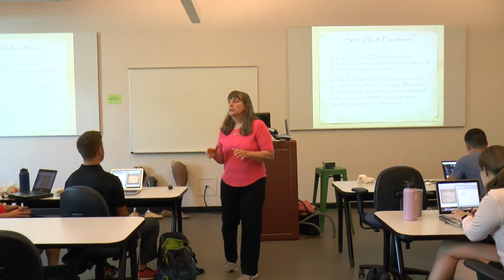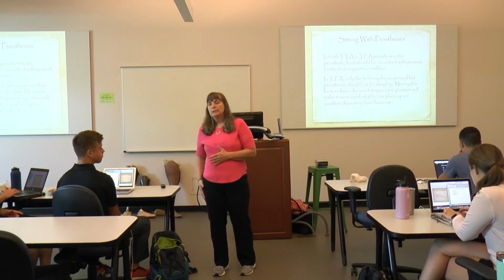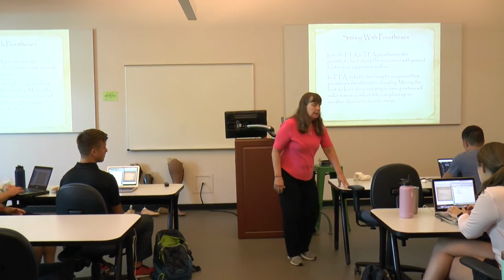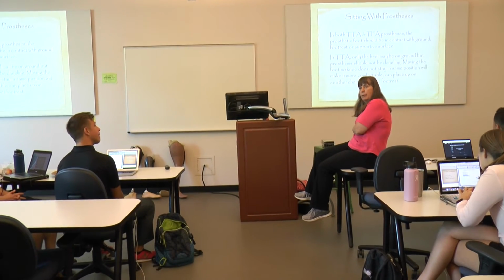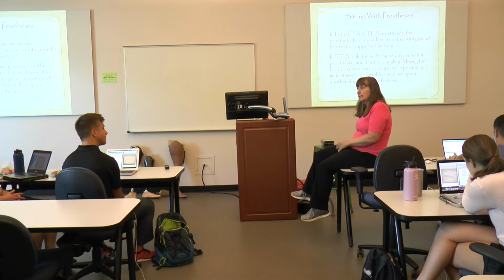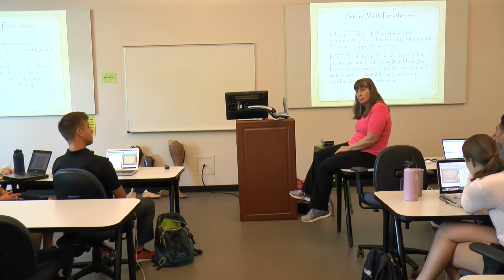One thing I do with transfemoral amputations now, when they sit, if I have a prosthesis on my right side, okay, my right hip is typically sitting higher. So if I have a prosthesis over here, my right iliac crest is higher than my left in sitting. This is going to lead to back pain. If I sat like this for an hour or two watching a movie, do you think my back would hurt?